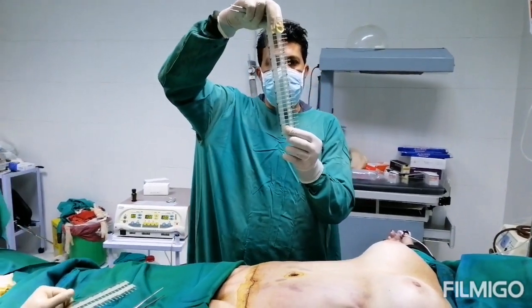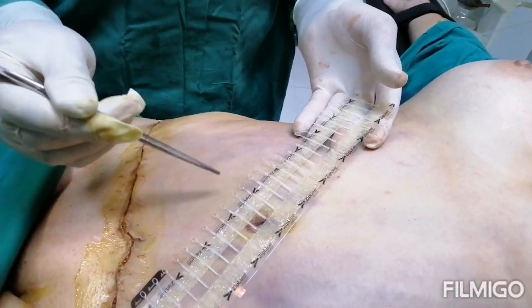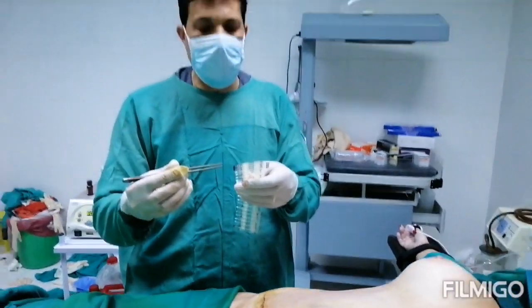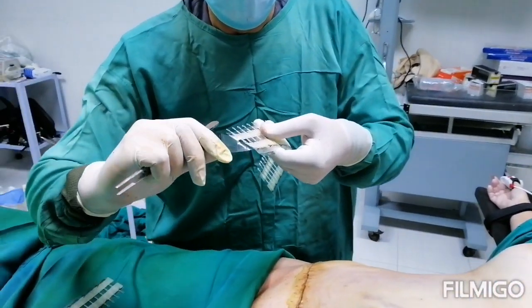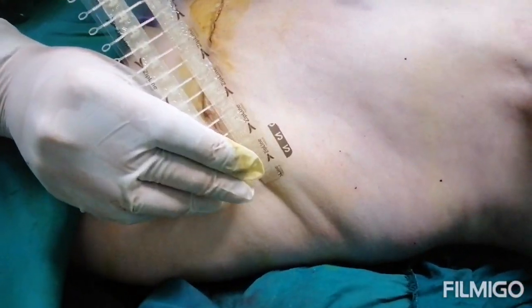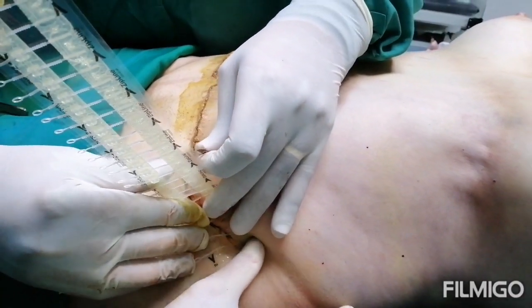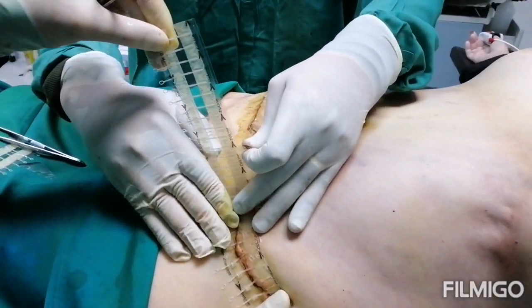This is called the zip line. It comes like strips with some plastic links to pull it down because the tension will be on this part, not on sutures. We'll show you how we close the wound with the zip line. First of all, we remove this part. Then we fix it at the edge of the wound. An assistant will help to hold the wound. We go step by step until we go over the entire wound.